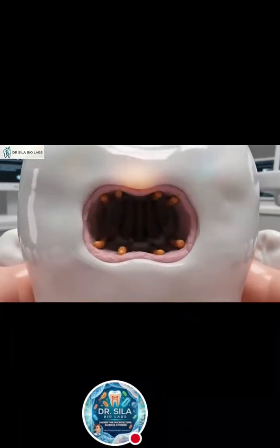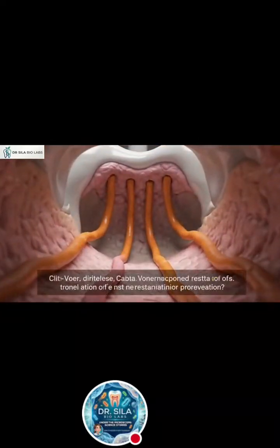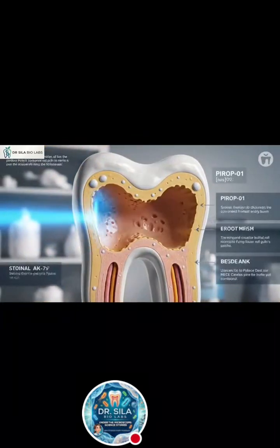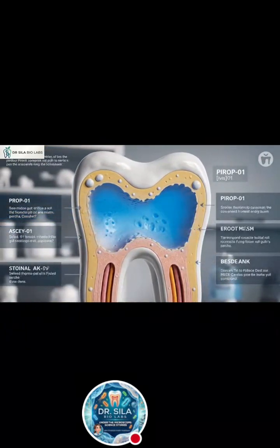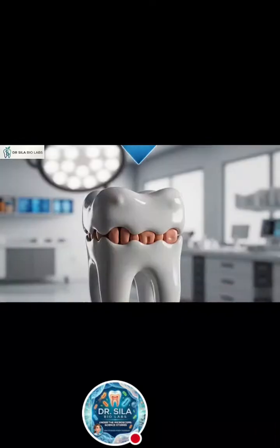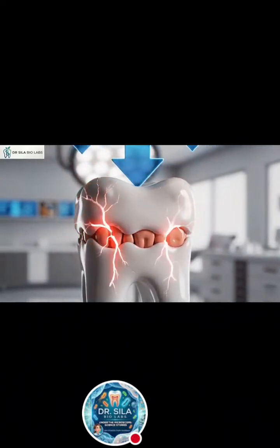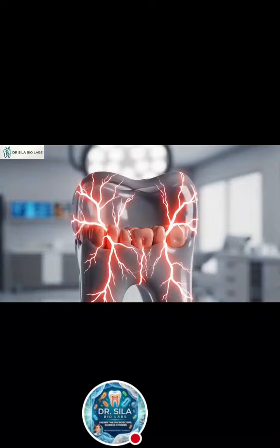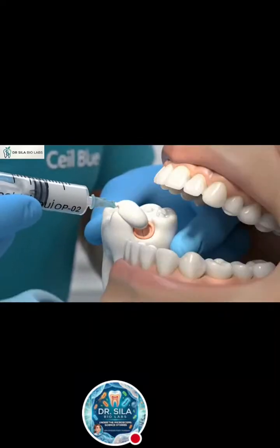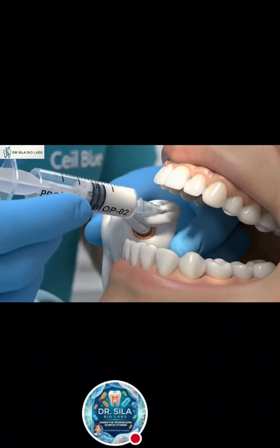After root canal treatment is completed, the tooth must be restored to regain its strength and function. Teeth that have undergone root canal therapy often have significant loss of tooth structure due to decay, previous restoration. As a result, they may be more susceptible to fracture under normal chewing forces. To reinforce the tooth, a core buildup is often placed to replace missing internal structure.